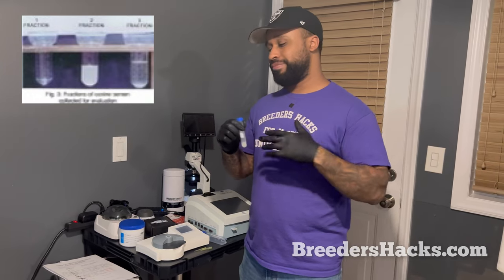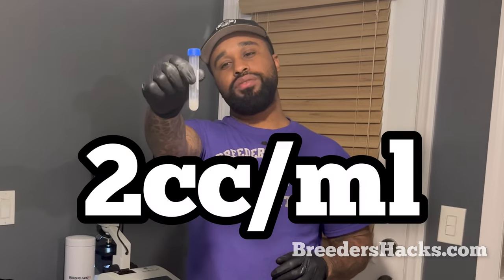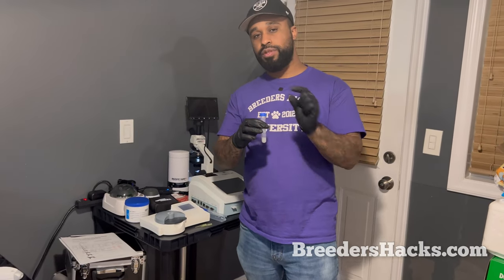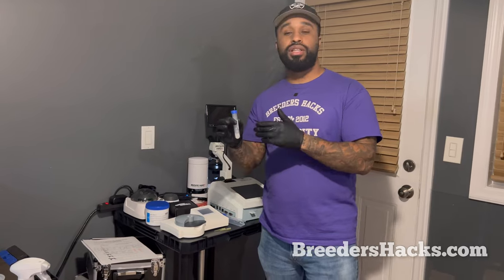Once it goes clear, I don't even bother collecting anymore because there's virtually no semen in it. So we have our collection here, right? We're just a little bit shy of about 2 cc's, 2 mL of sperm-rich fraction. We don't really care for the pre-ejaculate, which is the little bit of clear drops in the beginning. We only want the cloudy in the middle, and I've done episodes talking about this, and at the very end, we don't want the clear stuff as well.